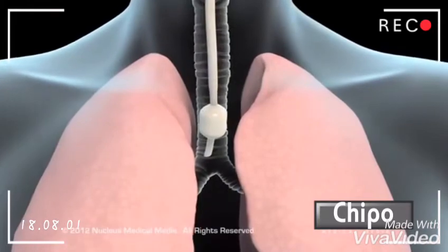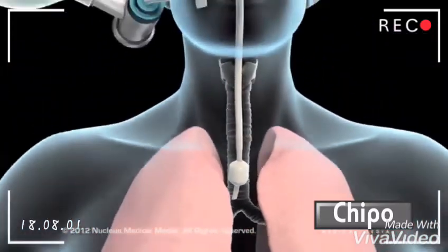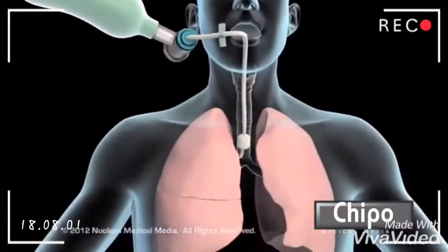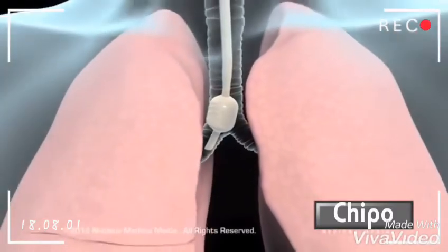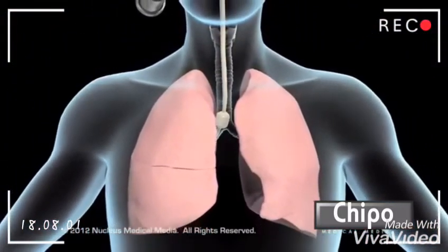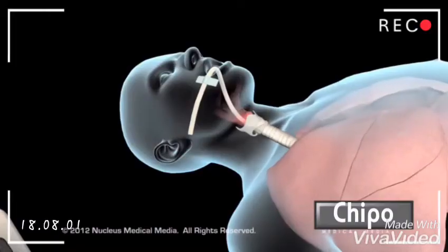After the procedure, to be sure that the tube is in proper position, the lungs will be inflated with a special bag and the chest is checked for breath sounds on both sides. If the end of the tube is mispositioned, both lungs will not receive the same amount of air. In some cases, an X-ray is taken immediately after intubation to confirm the tube's placement.